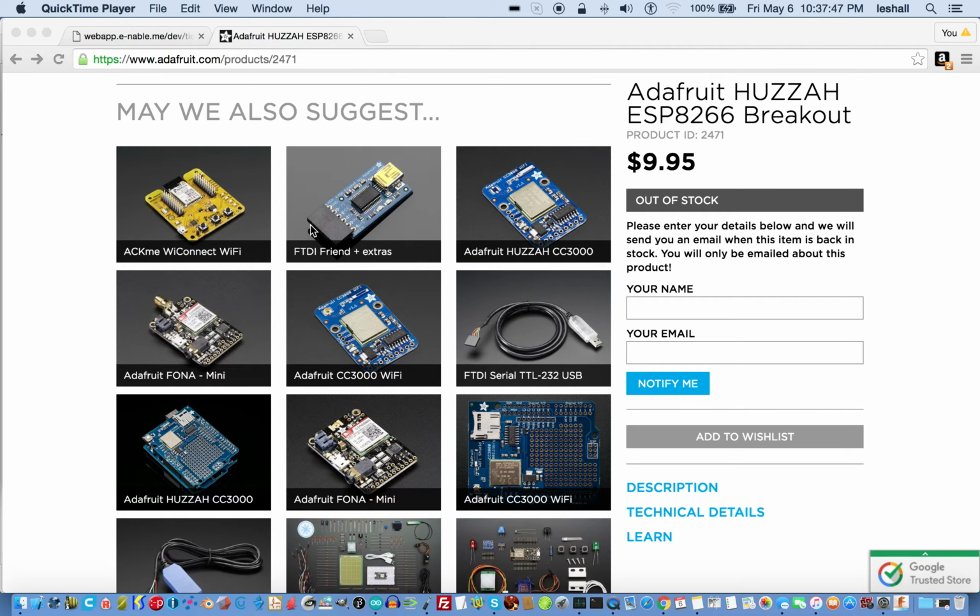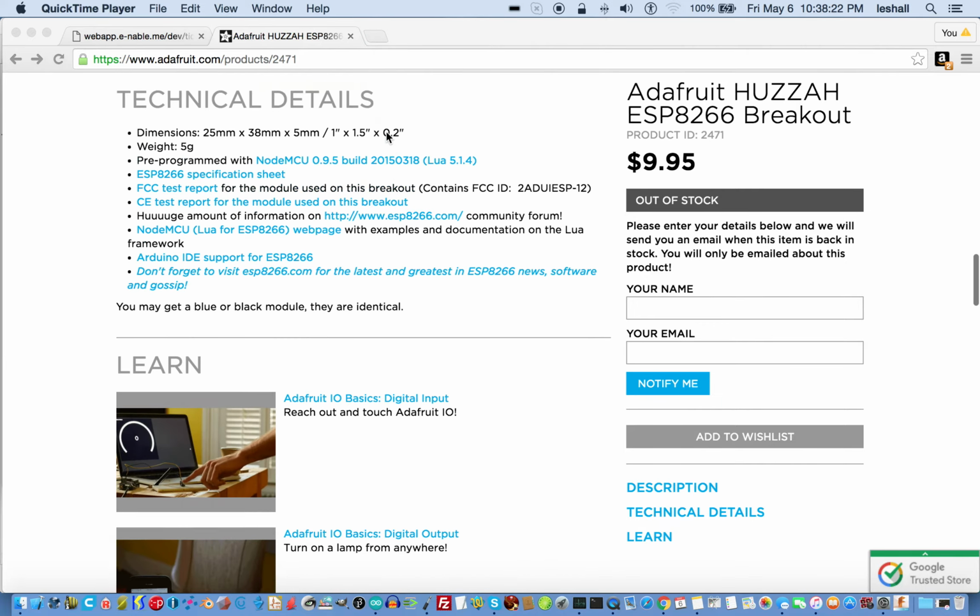This is an FTDI friend. So we're going to plug this end, the mini B end, into a mini B connector, plug this end into the ESP8266 board, and then finally plug the USB into the computer. I find that's the best order for doing it. Then, once you have that connected, there's a little button sequence that you go through. See, I'll show you the buttons.